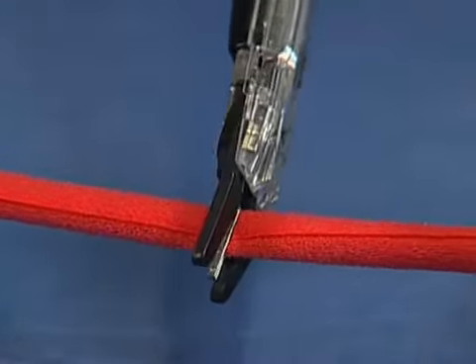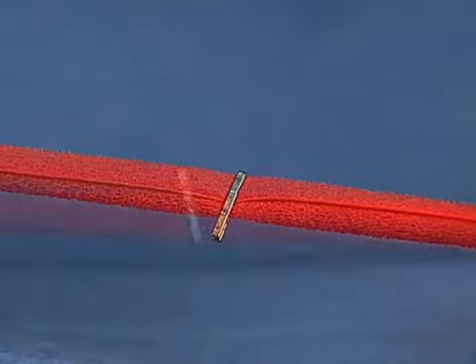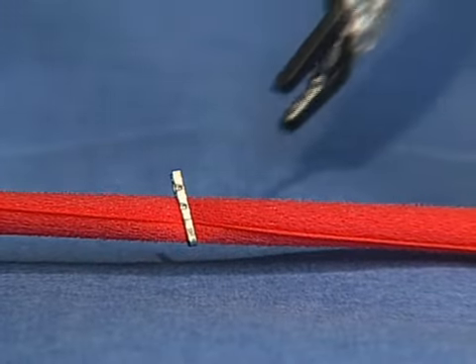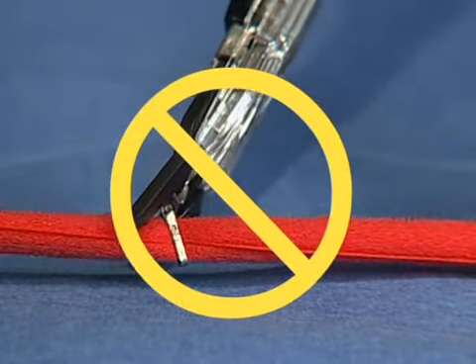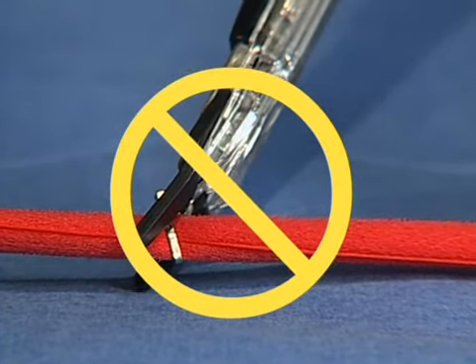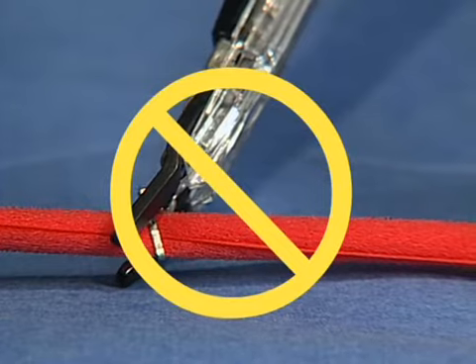Release the handle to disengage the clip and remove the applier from the vessel or structure. When applying clips, avoid placing a clip across another clip or other hard obstructions, as this may also result in clip malformation and possible bleeding or leakage.